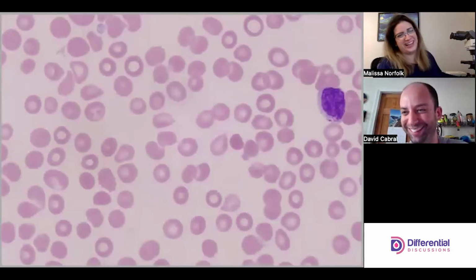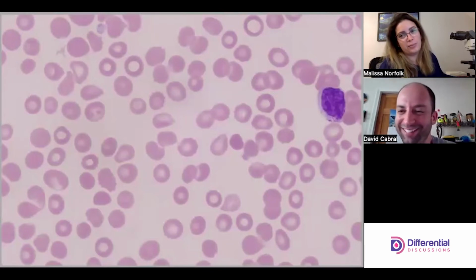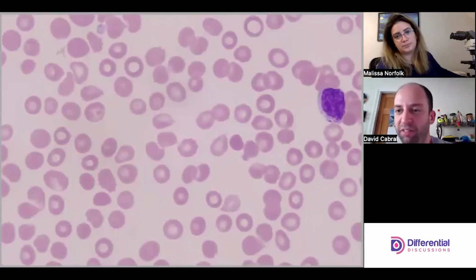Is this a lymph? Ugh. So I think it's a myelo. Yeah, it's ugly. Oof. It's very ugly, but it's eccentrically placed. The chromatin pattern is very clumped. Older myelo. Yeah, and the cytoplasm I feel like is more saying I'm a myelo than a meta. So lots of clumping in this chromatin pattern. Yeah. I don't even want to talk about this one.